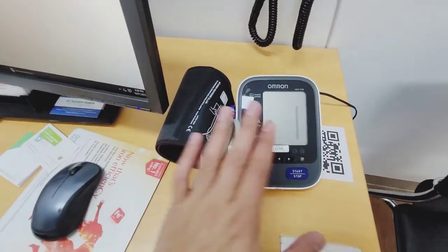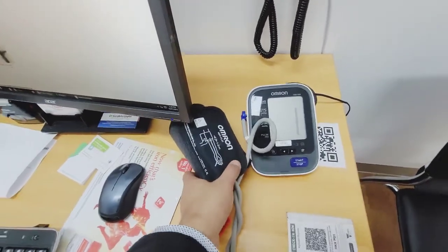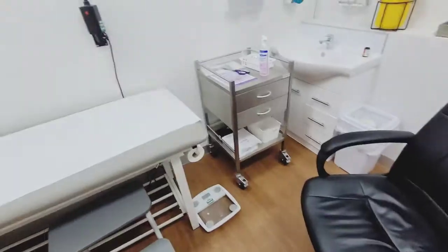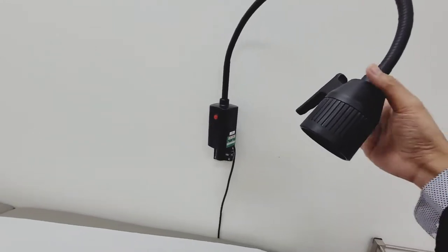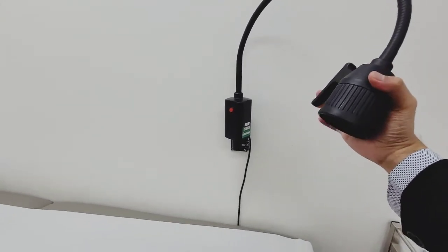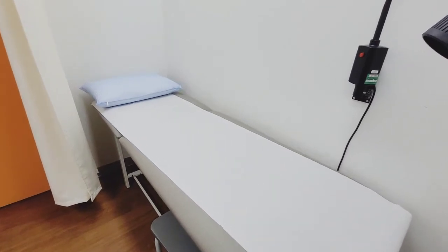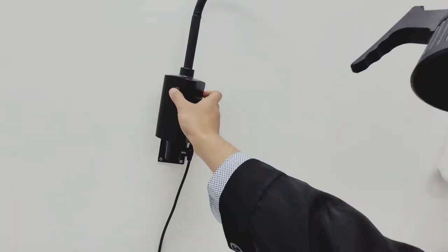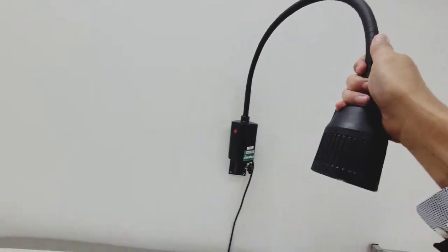And then obviously you already know what this one is for. This is what we call the blood pressure machine. This is an automatic blood pressure machine. And then this is our examination light, guys. This is where the patient will lie down if we need to do some examination. We use this light, we just turn it on. There you go. And then we adjust it.